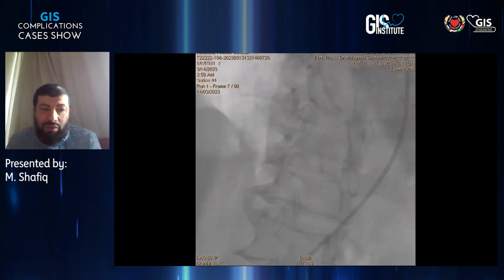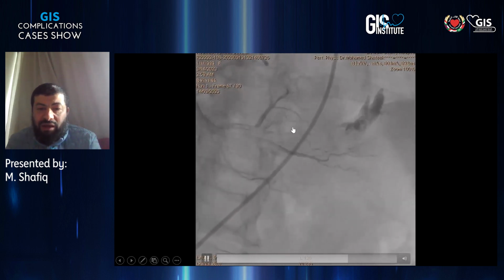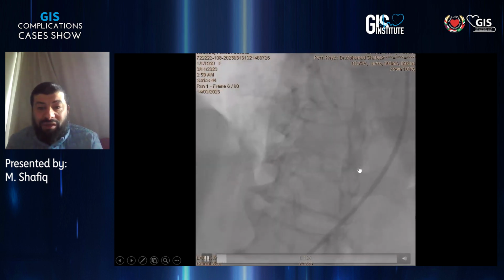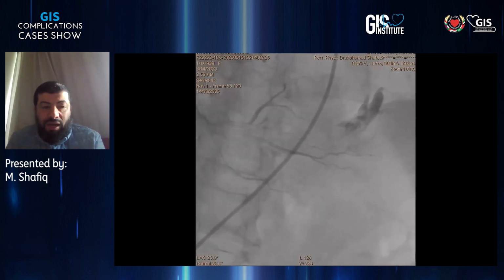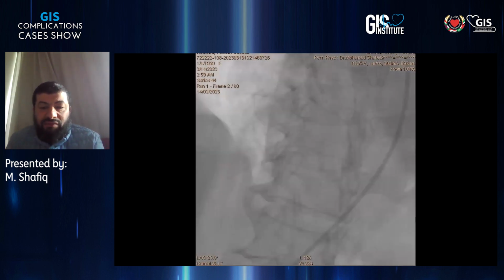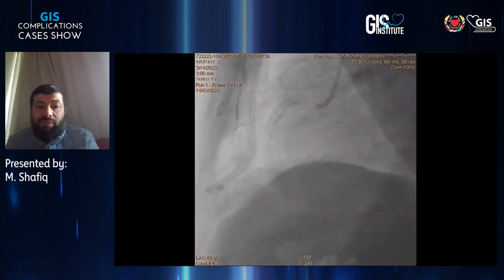Now no effusion. Also, after 25 minutes of inflation of the balloon, I rechecked, but the pressure increased, unfortunately. So what to do? I don't have a graft stent, and the manual graft stent cannot work in this distal vessel, mostly calcified, long, with a proximal stent.